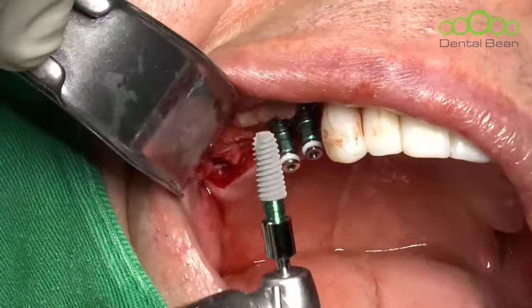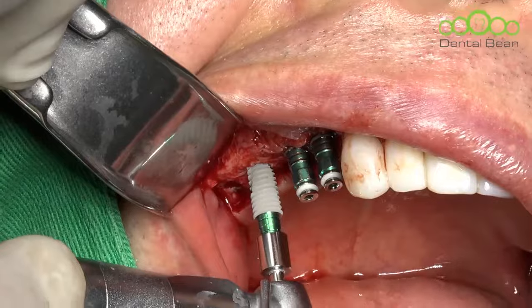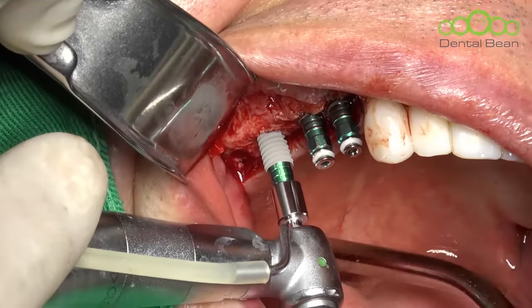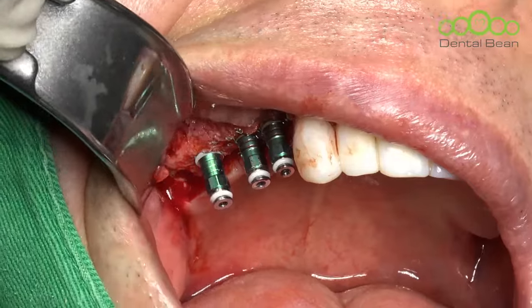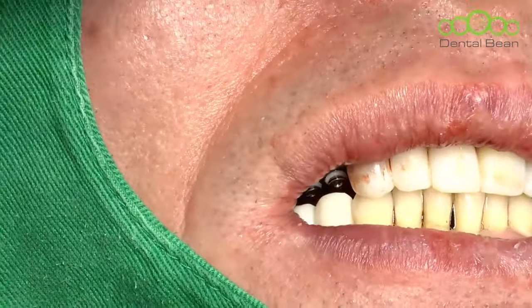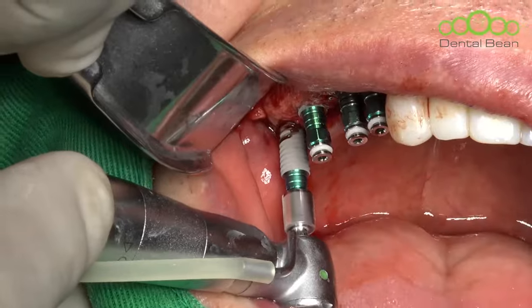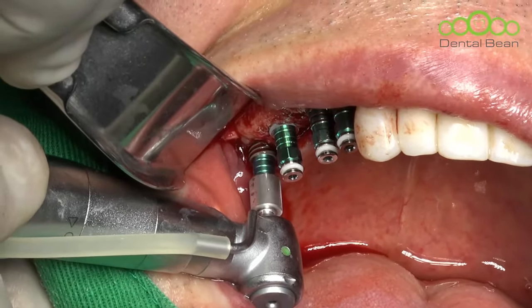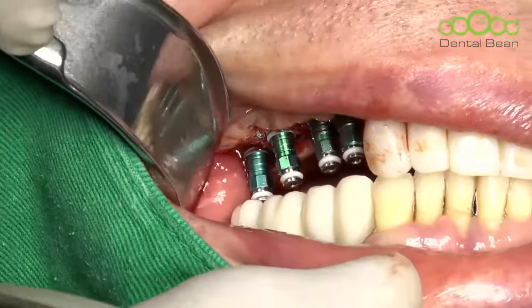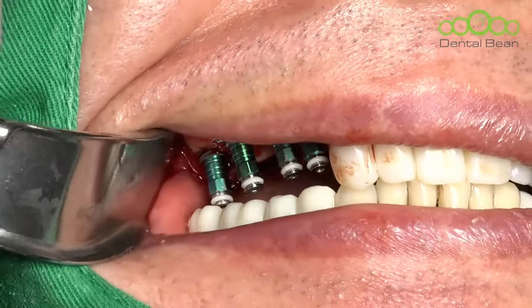4.5, and I place a 4.5 implant at molar site. Okay, close. I'm checking occlusion. Not bad. Then let's place one more at molar site. 10, 11. Close mouth. Okay, good. One more. Last implant. Okay, not bad. They're minor. Open please.